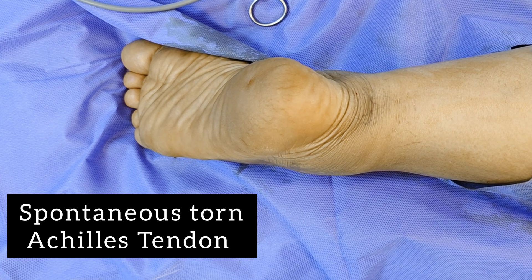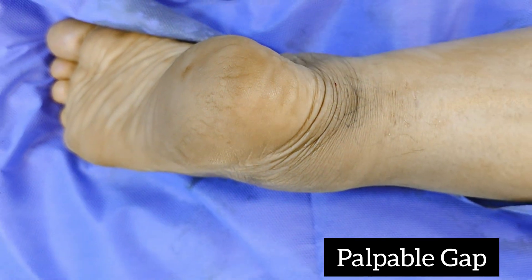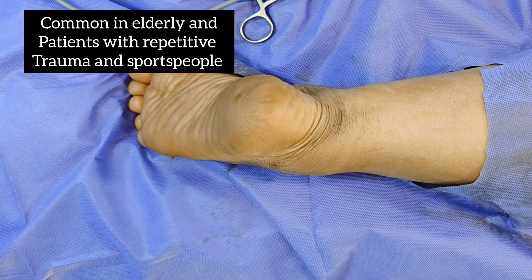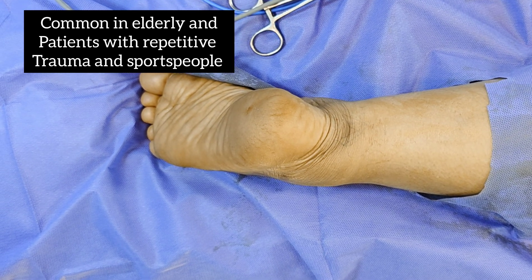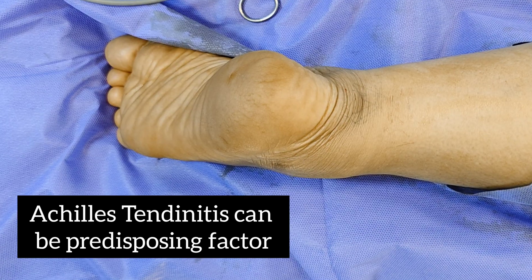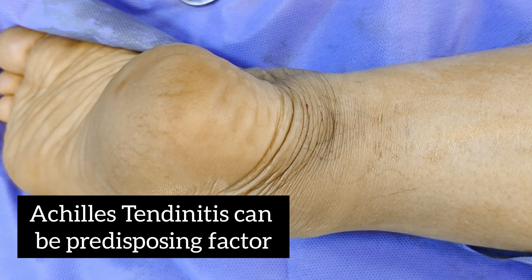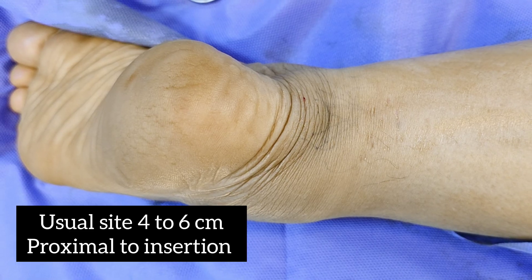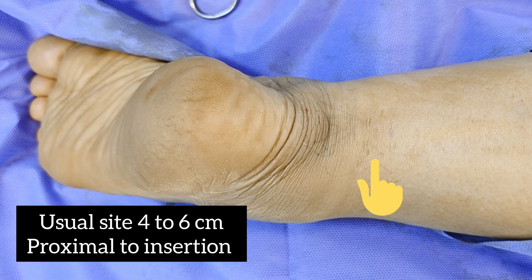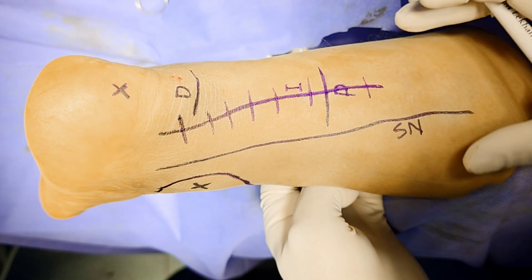This is a case of a 64-year-old female, known case of diabetes and hypertension. She presented as a case of spontaneous rupture of Achilles tendon. Achilles tendon rupture is common in patients with poor health, steroid intake, and sometimes antibiotic intake like fluoroquinolone. It is usually predisposed by inflammation around the tendon and typically occurs at the site 4-6 cm from the heel area.